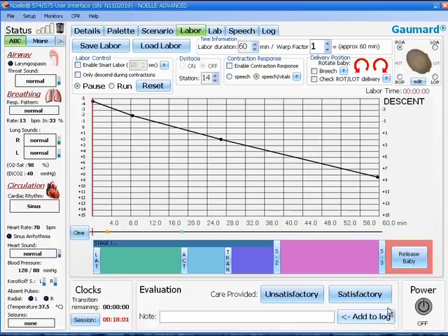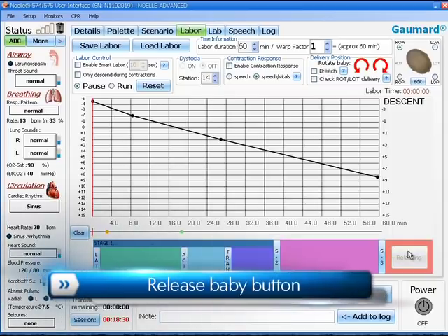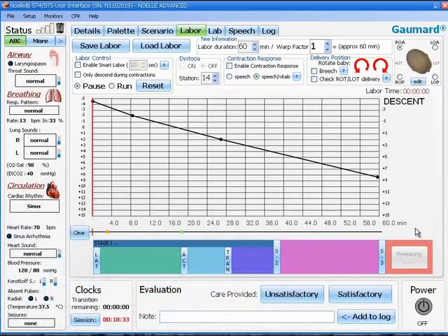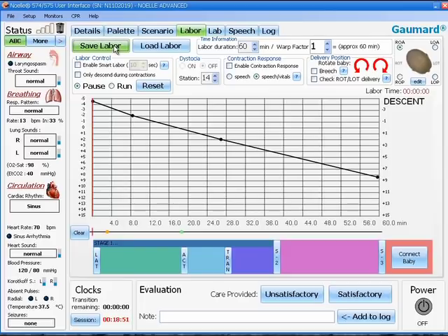On the far right of the labor window at the bottom is the release baby button. This can be pressed any time by the instructor to release the baby from the birthing mechanism. When you are satisfied with all the changes that you have made to the labor screen, you may now save your labor. This is done by clicking save labor on the top left.